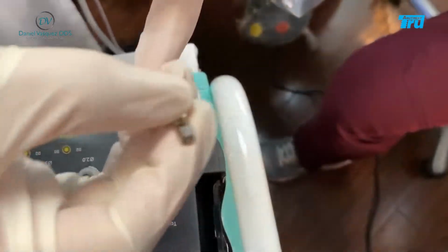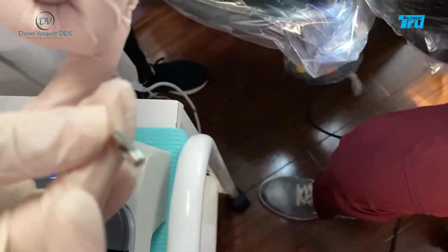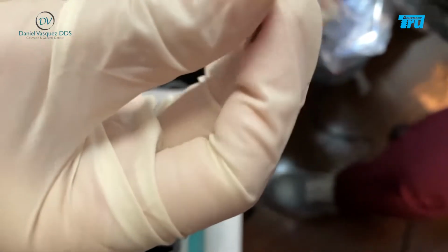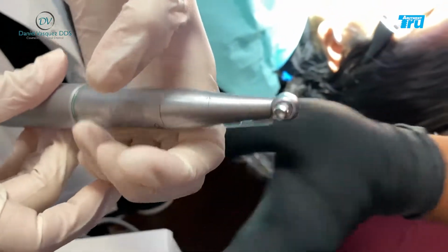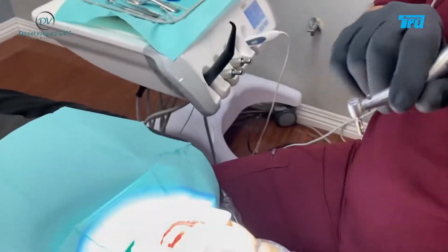Excellent. Okay, now we're going to be using a tissue punch. Like in this case, we did the treatment plan on the 3D. We don't need to open a flap in this case, so all we're going to do is use a tissue punch.